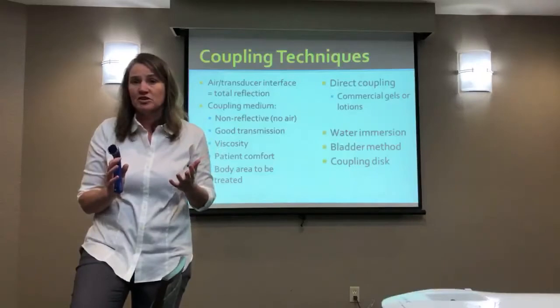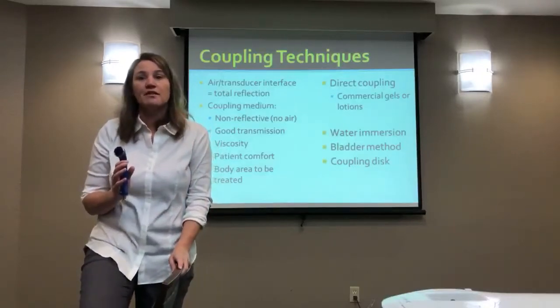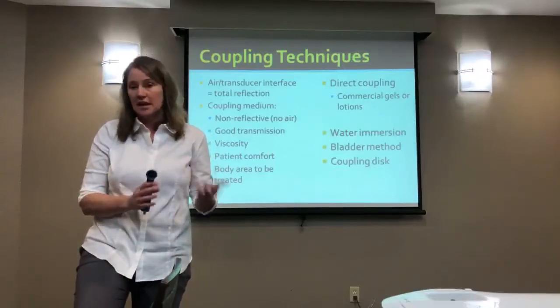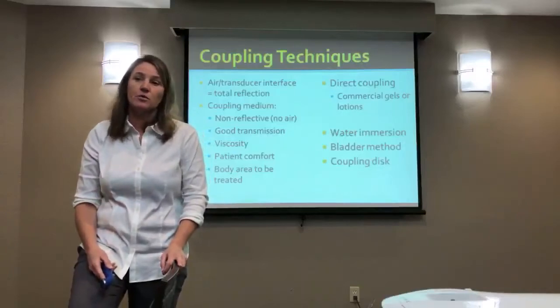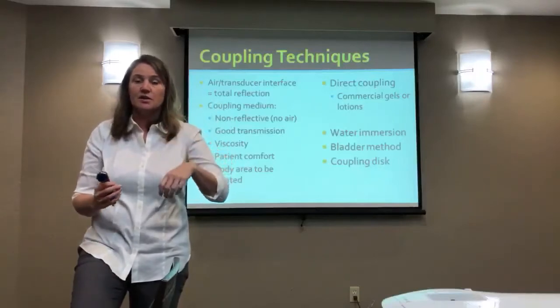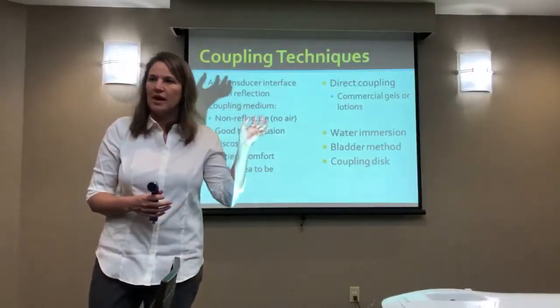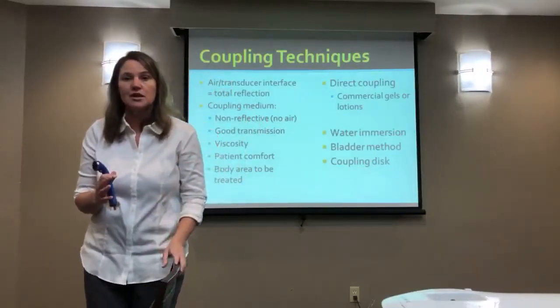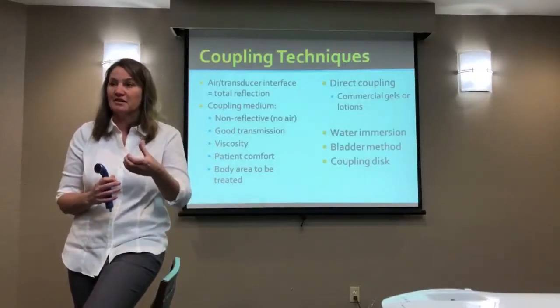That should be something we're all concerned with in this day and age, especially if you're in an environment where you have primarily inpatients and they're immunocompromised in any way. You definitely need to consider that. I do think more and more people have gone away from the giant bolus of gel that you refill the containers. I know it's less environmentally friendly, but disposable bottles that you throw away are more likely to be less contaminated. They're less likely to get contaminated over time than the ones you keep refilling again.